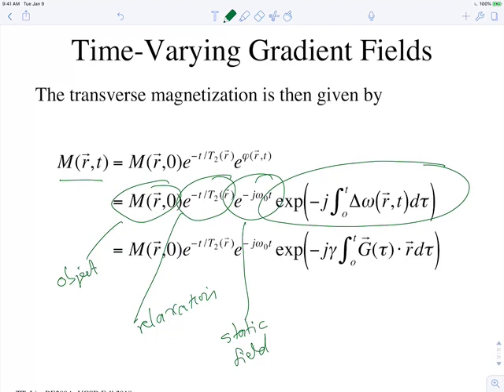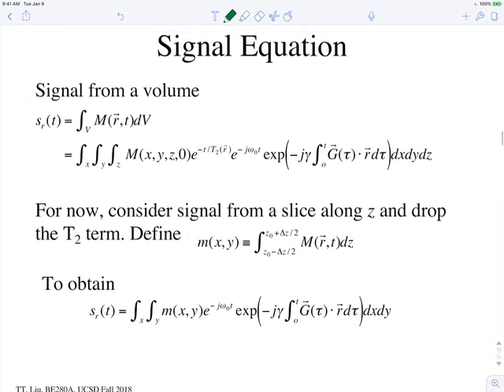So that's basically accumulating. This is just saying, what is my phase at every point in time? And we're just saying that phase is both a function of the gradients and then time. And it's basically the history of the gradients, okay? So at the end of the day, all we're going to be doing is integrating gradients, okay? So let's take a look at that.